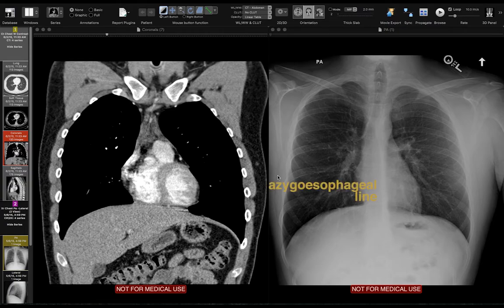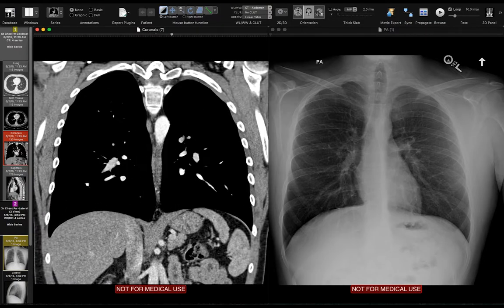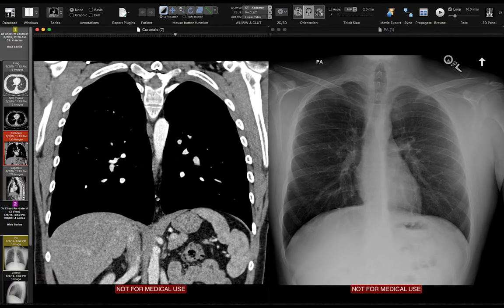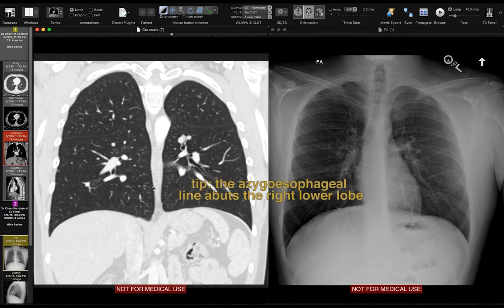The next thing that I look at is the azygoesophageal line. The azygoesophageal line is exactly what it sounds like — it's the interface that the azygous vein and the esophagus form with the adjacent lung. That line starts here at the diaphragm and you can see it go up, and when we get to about the level of the carina, we lose that line as it gets obscured by other structures. On CT, this is the esophagus — the lucent tube structure — and this is the azygous vein, right next to each other. What we're looking at on the chest x-ray is that interface between the azygous and esophagus and the adjacent lung.